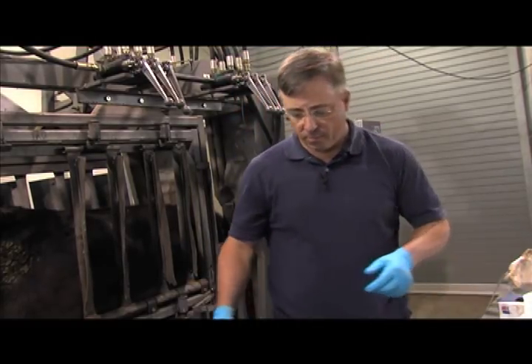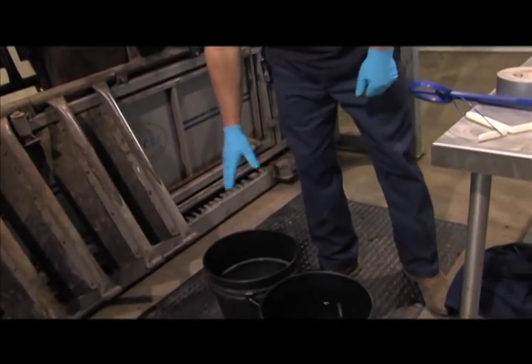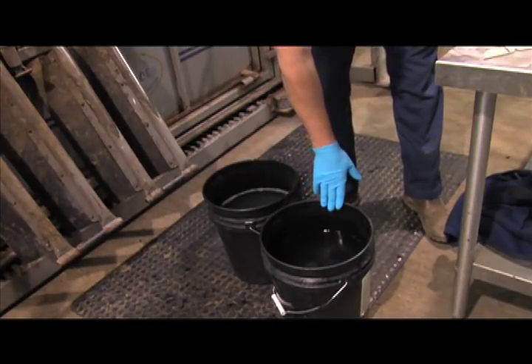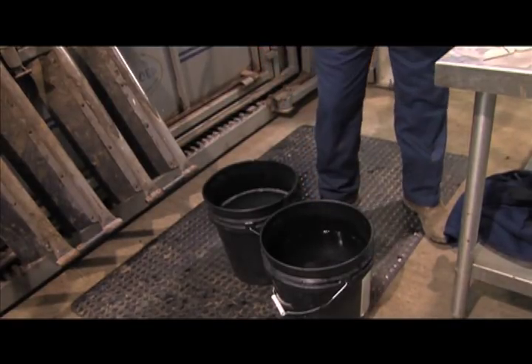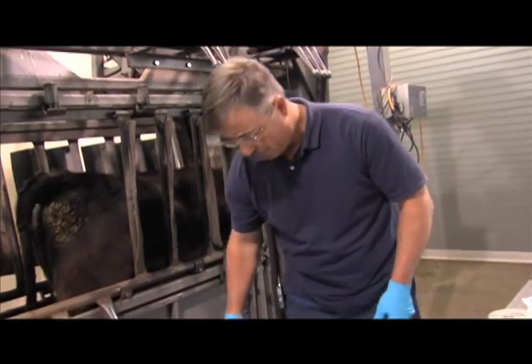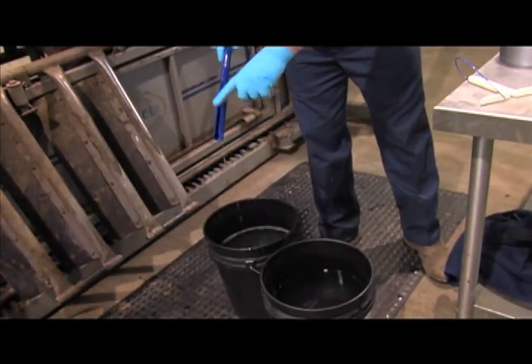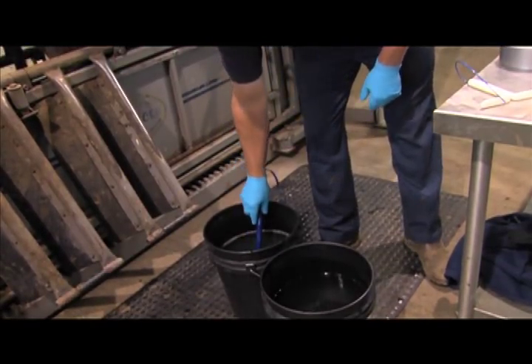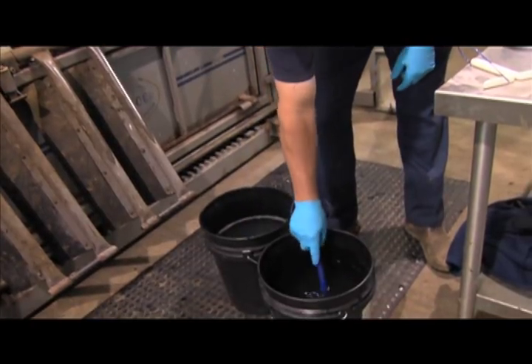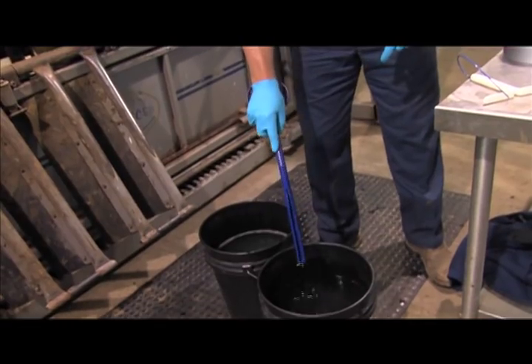The first step is to get two buckets — one with the disinfectant and one with just water. You'll take your cedar applicator and put it first in the disinfectant with the grooved end down. Then you'll rinse the disinfectant from the cedar applicator in the bucket of water.